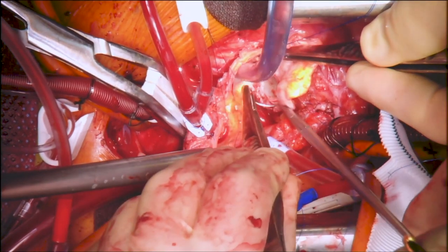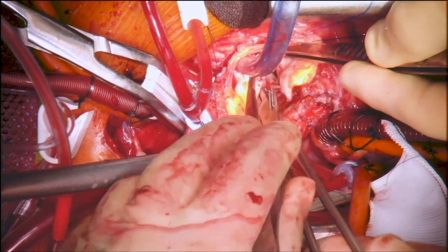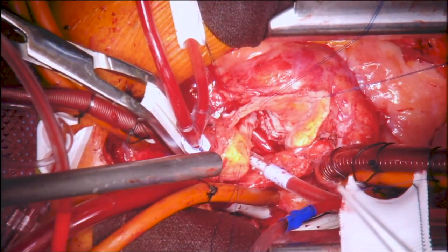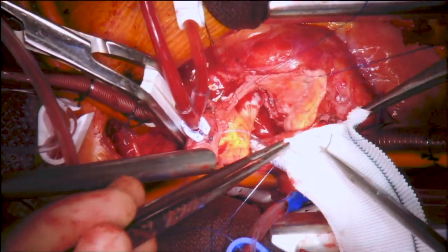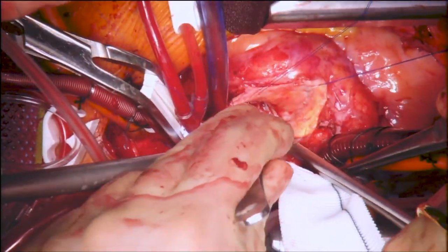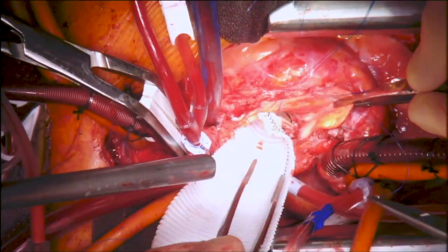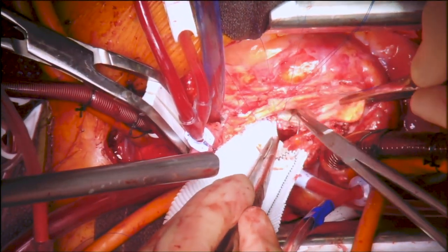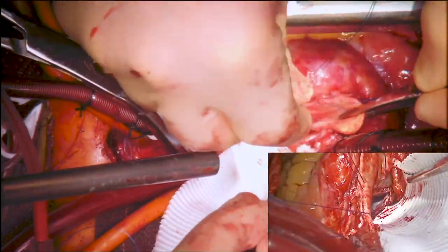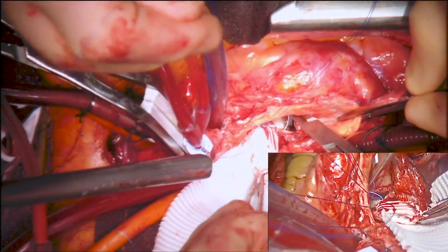The patch was then sutured to the annular enlargement area using 4-0 prolene sutures. Suturing was started on the left cusp side around the corner, and the patch was parachuted down. This was followed by running the suture line along the bottom of the enlargement all the way to the corner of the aorta and the annulus on the non-coronary side.